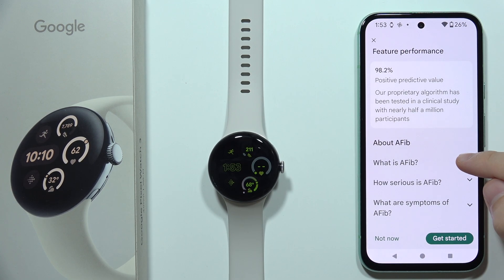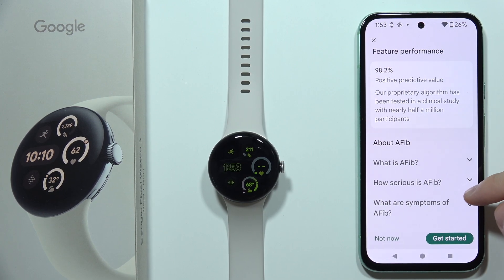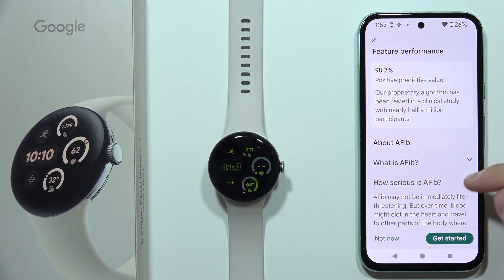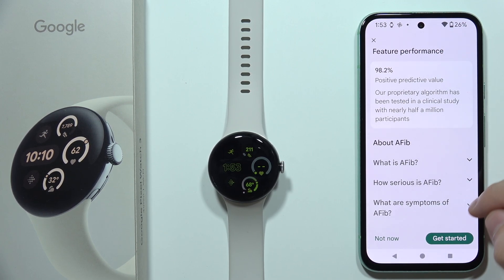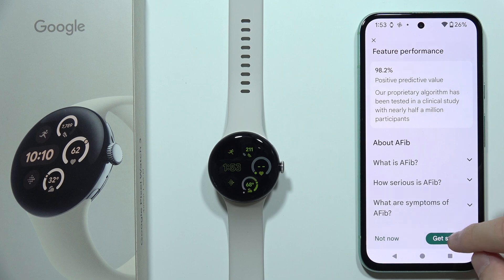Click 'Get Started.' By the way, before you start, you can also read what it is and what it does about the symptoms.